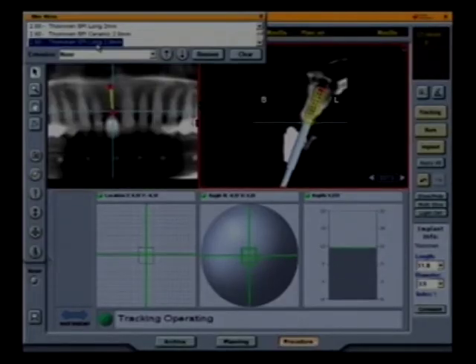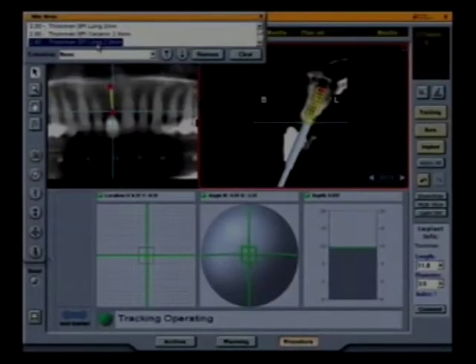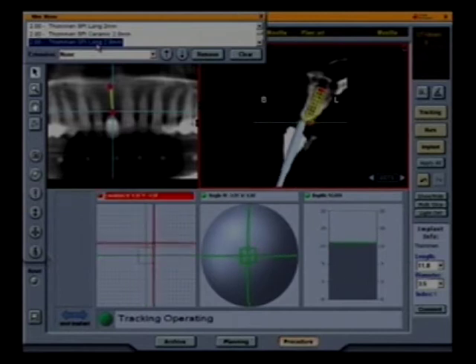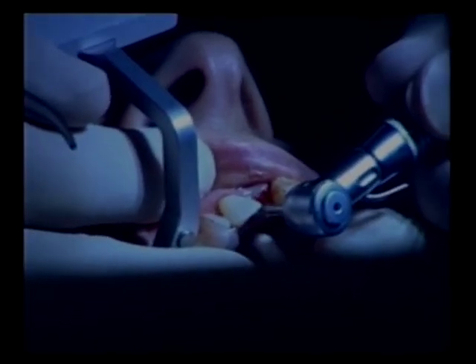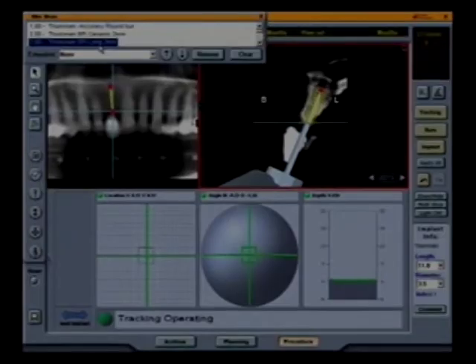Small adjustments can still be made if need be. You could change the position of the implant on the software and carry out that plan in just a matter of a minute or two. So again, flexible — allows some on-the-fly adjustments. We're approaching the depth. Should be there in just a second. It will start to beep and turn red.